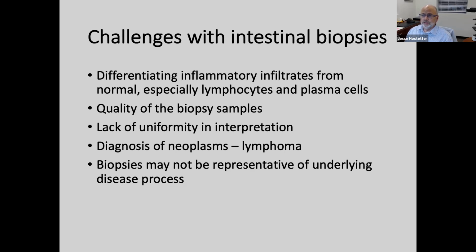This is a difficult procedure. There is a steep learning curve. And I will tell you that there are people out there who are artists at this technique and always generate beautiful endoscopic biopsies. But at the beginning of that curve, I think sometimes you get biopsies that are a little more variable and maybe not quite what you were hoping for.